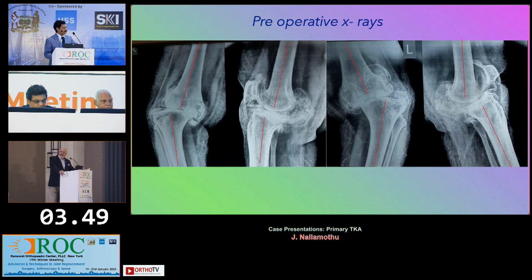I agree. Anybody want to add anything? The tibial downsizing also will be partly helpful, because looking at the femur, the tibial flare on the medial side can also come down, which helps you accommodate the varus. A little reduction osteotomy? Yes. Good. All right, so tell us what you did.